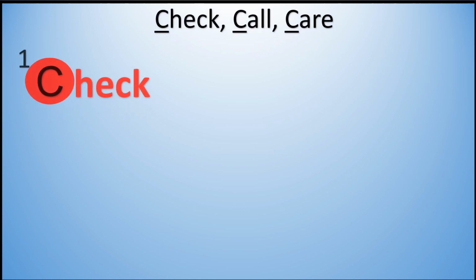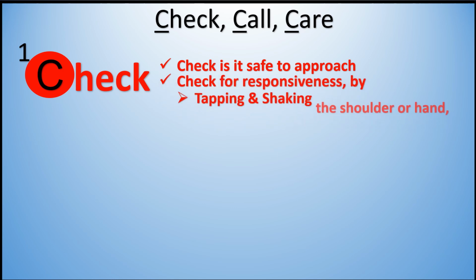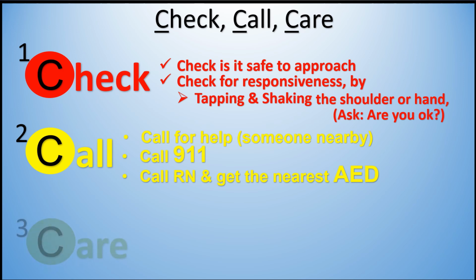Check. Check, is it safe to approach? Check for responsiveness by tapping and shaking the shoulder or hand. Ask, are you okay? Call. Call for help. Someone nearby, call 911, call RN, and get the nearest AED.